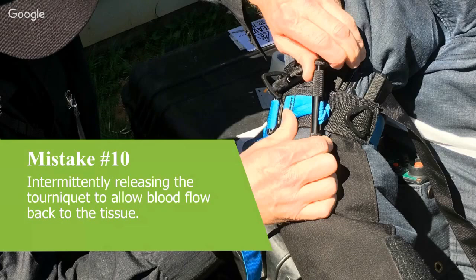The second reason is, if you start loosening off tourniquets, once you've tightened them properly, particularly the CAT, due to its internal ribbon being a little bit more flimsy than the softies, you'll stretch that ribbon, and then when you loosen it off and go to reapply it, you're not going to be able to generate the same amount of tension a second time. So even if you did do this successfully and then reapplied it, there's no guarantee that the tourniquet is going to work a second time.